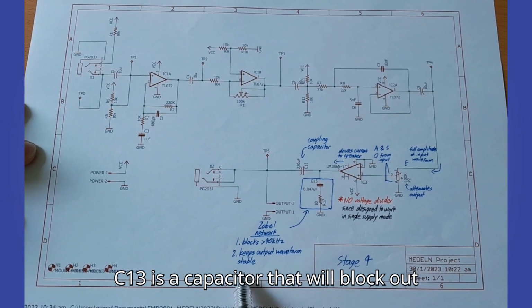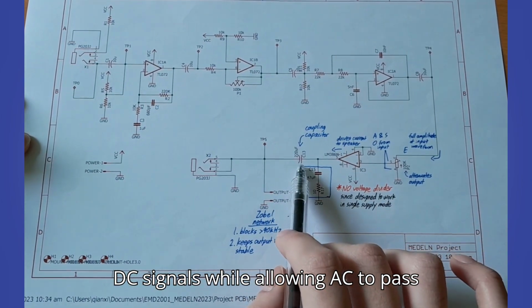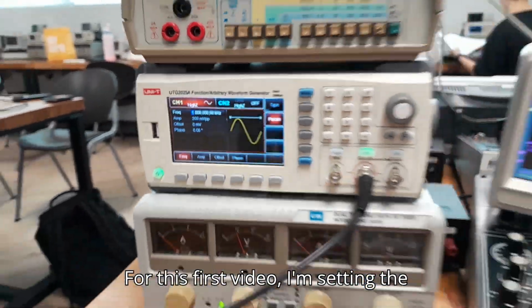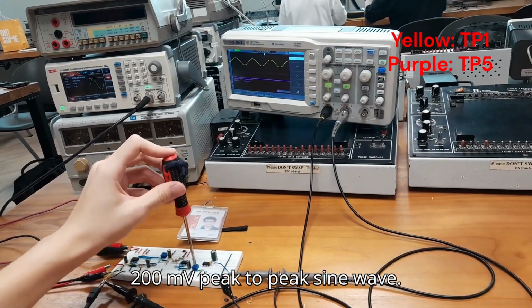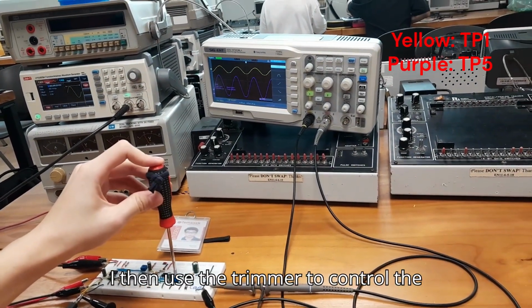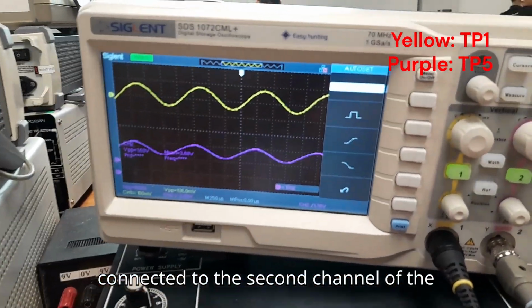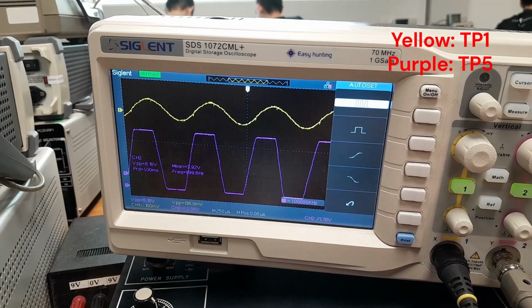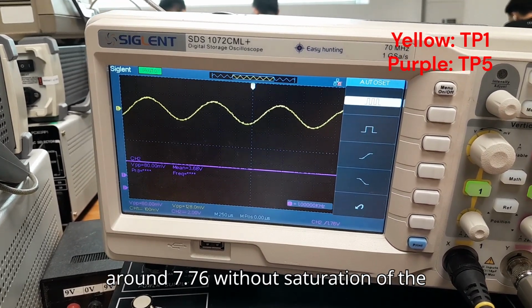Once again, C13 is a capacitor that will block out DC signals while allowing AC to pass through. For this first video, I'm setting the function generator at a 1 kHz 200 mV peak-to-peak sine wave. I then use the trimmer to control the output waveform at test point 5, which is connected to the second channel of the oscilloscope. The output voltage obtained here is around 7.76 volts without saturation of the sine wave.